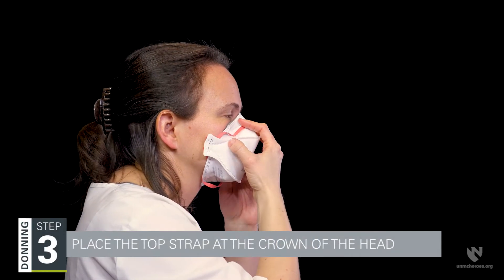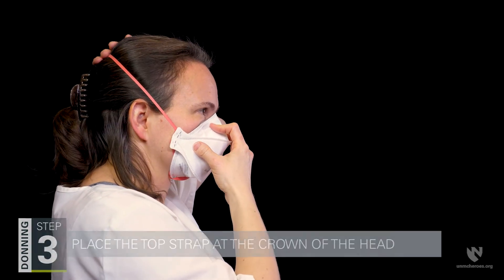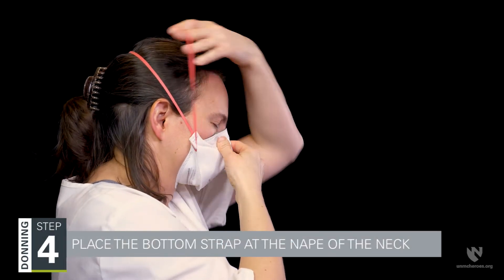Step three is to place the top strap at the crown of the head. Step four is placing the bottom strap at the nape of the neck.